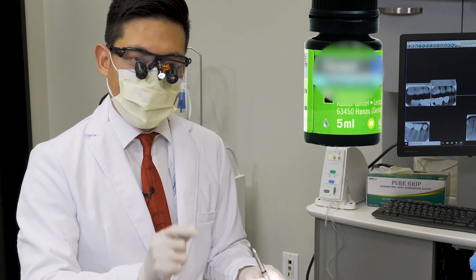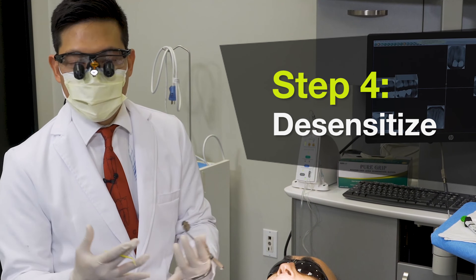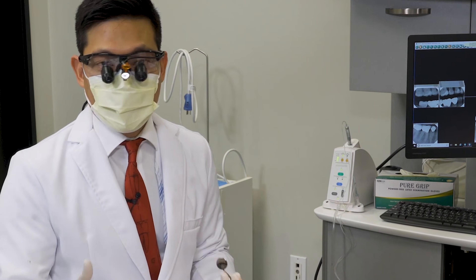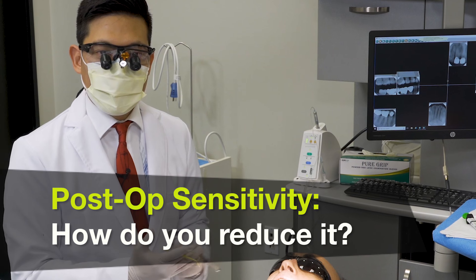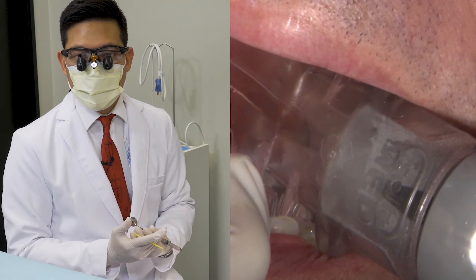This is a vital tooth. For most vital teeth, I do like to apply a desensitizer. We're going to put a little bit of a layer of desensitizing agent. In an effort to remove contamination — whether that's saliva or blood on the preparation — we can actually inadvertently desiccate the tooth. We don't want to desiccate the tooth, which could lead to post-operative sensitivity. A nice way to combat that, which has been proven to reduce the risk of post-operative sensitivity, is to apply a desensitizing agent on the preparation.